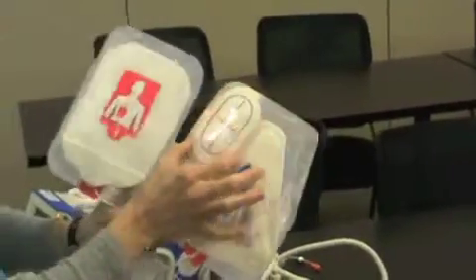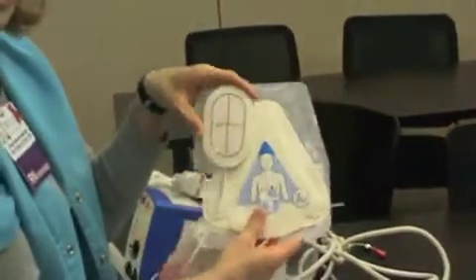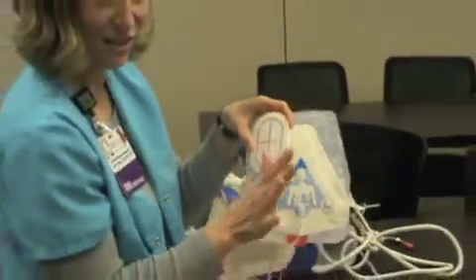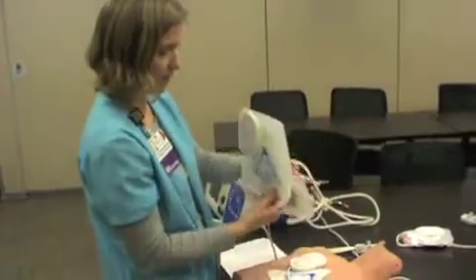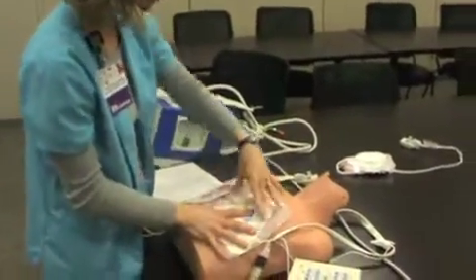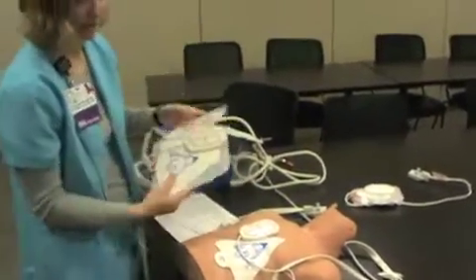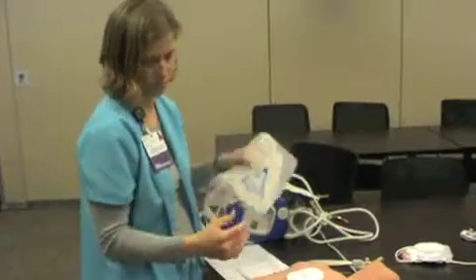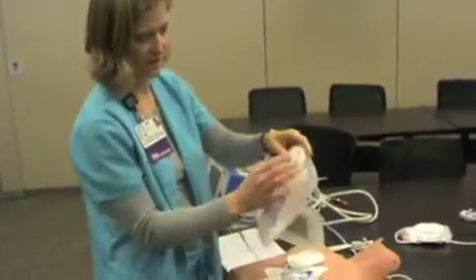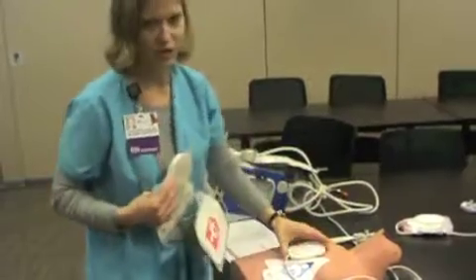Also, you'll see this little puck, hockey puck type thing, oval hockey puck. It is a CPR sensor that you're going to see all the features of in a minute. On a normal sized person, this would go right here, just all in one piece. Very easy to stick it on like this. If you have a large person, a woman with a large breast, it's okay to tear this apart. It's very important that this CPR sensor goes on the sternum.